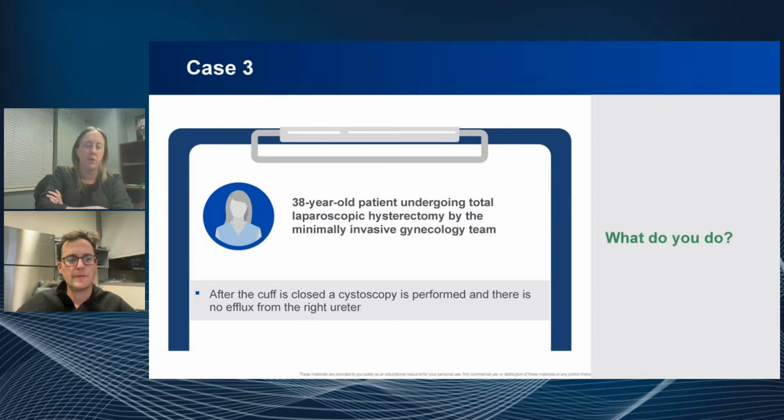And if you still have your laparoscope in, you can start to remove them, because that's probably what it is. If you really don't think that you've got this, you go laparoscopically, you trace the ureter, you can even dissect it out. If you really don't think it's a ureter, you can stent. Yeah. And after that, I call urology for help. If I find a ureteral injury, you can come into my OR and put that together for me.